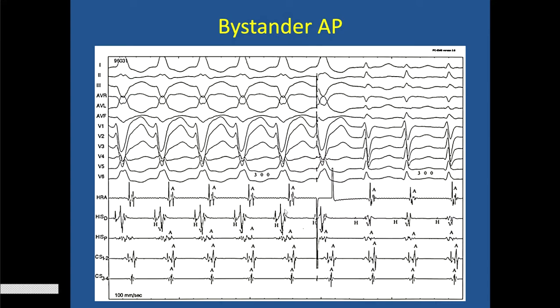One is a ventricular tachycardia. Two, where the His will not be in the earlier part, will be much more inside. I don't want to go into the EP part of it because the crowd is mixed. That's a different audience. So His will be much inside the QRS. In an antidromic tachycardia, the impulse travels from the atrium through the accessory pathway to the ventricle and then back. That's antidromic tachycardia.